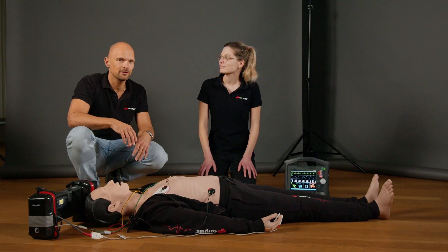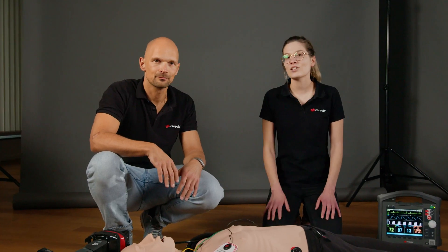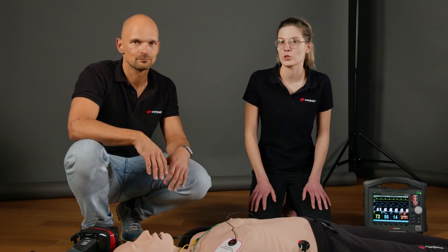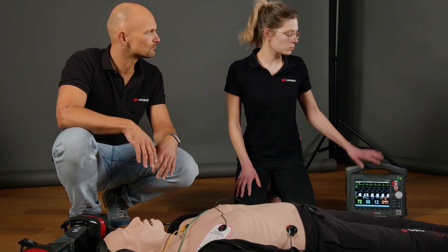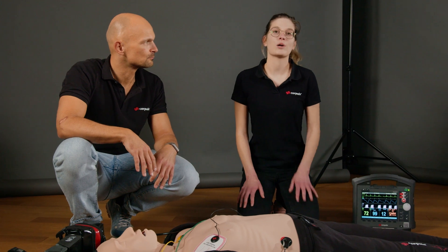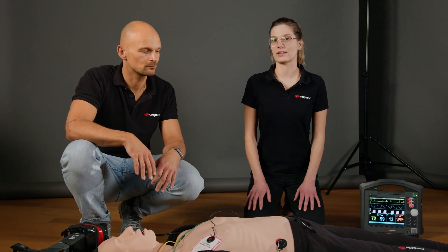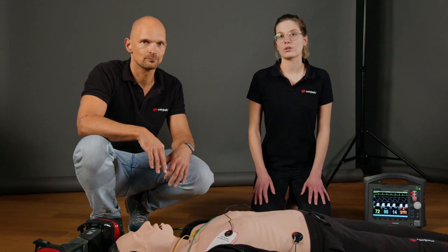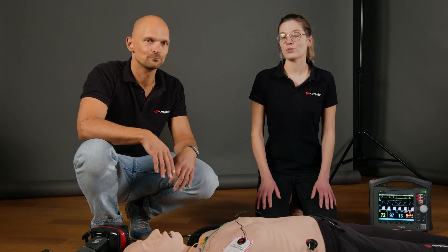Verena, could you briefly summarize the most important points regarding cardioversion? Sure. Cardioversion is the electrical therapy, meaning therapy of tachycardic arrhythmias. After the cardioversion has taken place, I need to check whether the rhythm has changed accordingly and whether I still have a pulse on the patient. It is also advised at this point to perform a diagnostic ECG — that is a 12-lead ECG or an ECG max, where I can also assess the posterior wall and the right side of the heart.